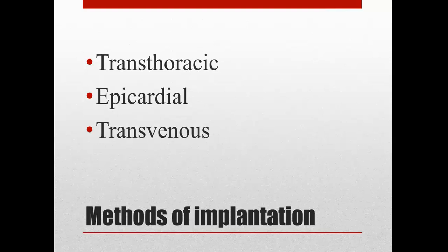Epicardial implantation is a less commonly used method of permanent pacemaker placement. It requires the patient to be put to sleep, and the recovery time is really prolonged. With that type of implantation, it's most often used in children and for adults that need open heart surgery at the same time as they need a permanent pacemaker. In this method, the pacing leads are attached to the outer surface of the myocardium, either during open heart surgery or through an incision just below the rib cage.